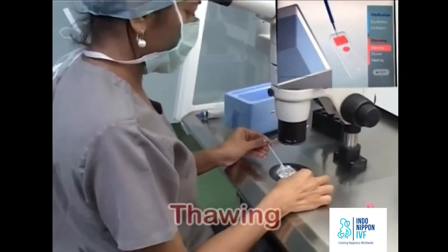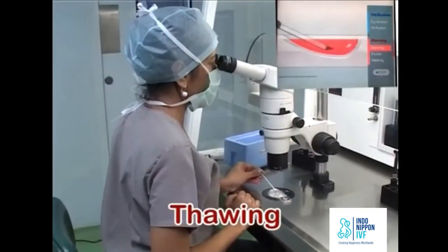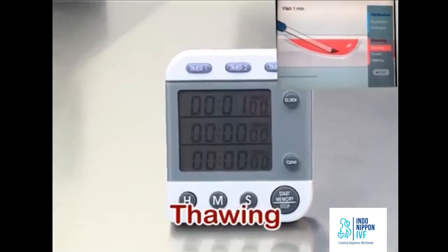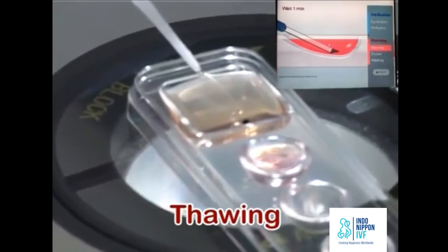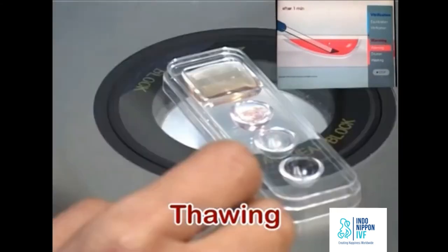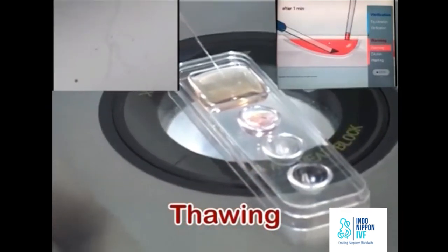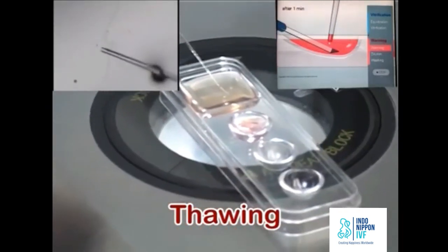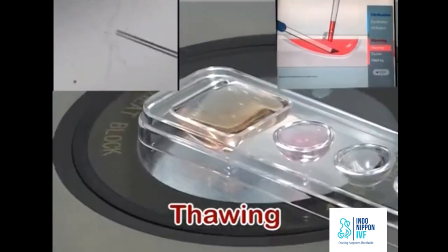Quickly immerse the cryotech into TS well within 1 second. This step is extremely crucial to achieve high warming rates. Start the stopwatch for 1 minute. Oocyte separates from the cryotech sheet by itself and begins to float. Confirm the oocyte existence in the TS well. Do not touch the oocyte for 1 minute. At the end of 1 minute, gently aspirate the oocyte and also aspirate TS till 3 mm length into the pipette.